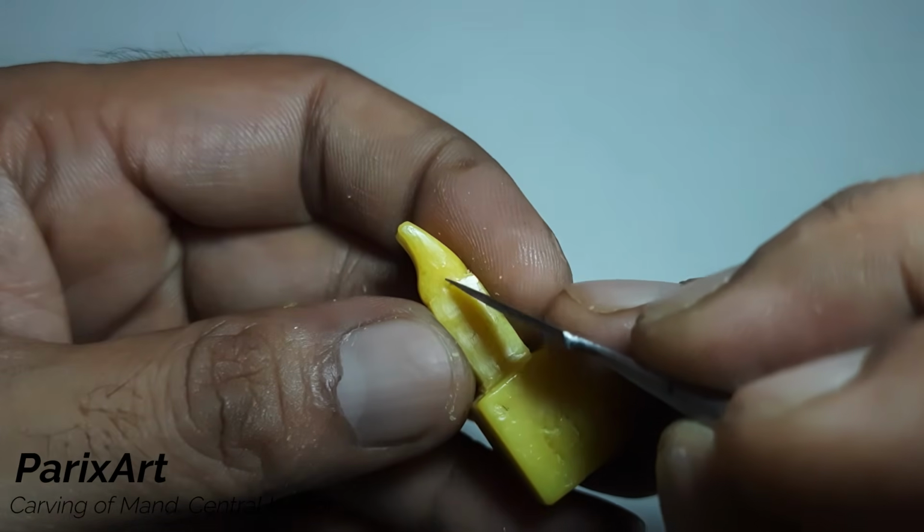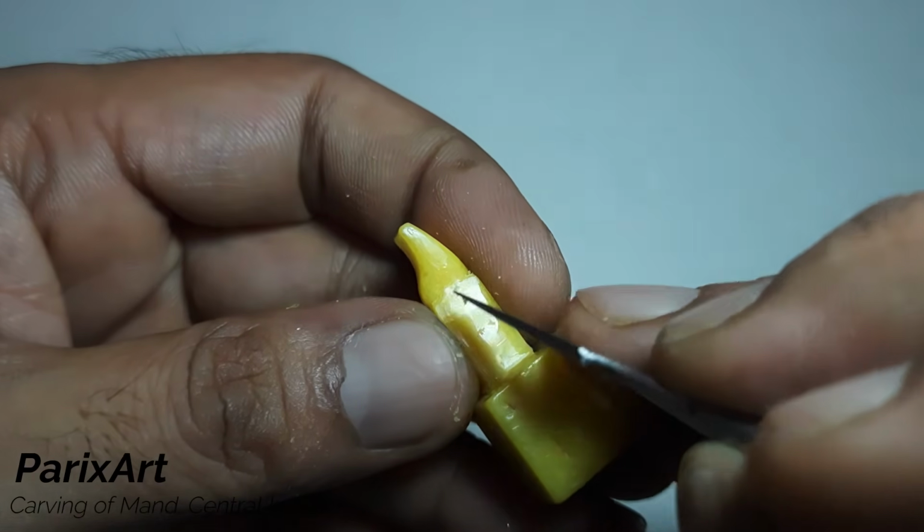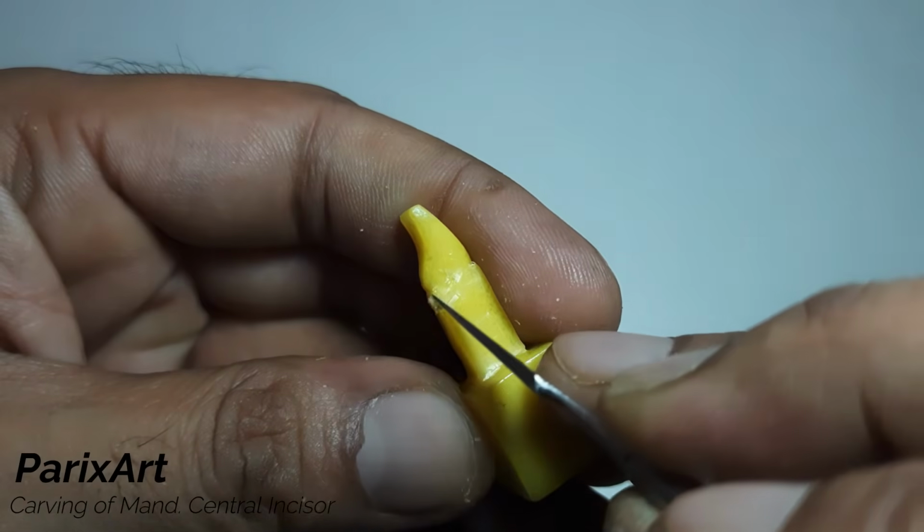Carve below this cervical line, following its curvature and the taper of the root. See?